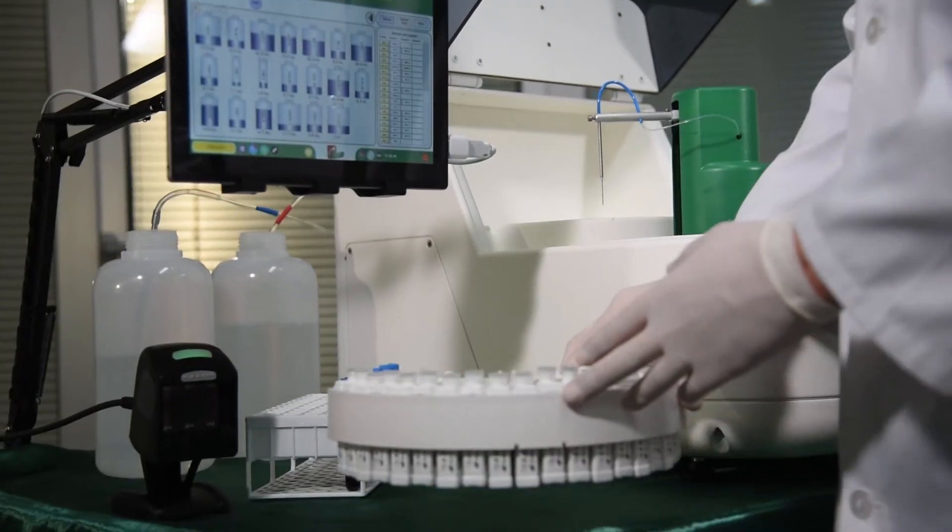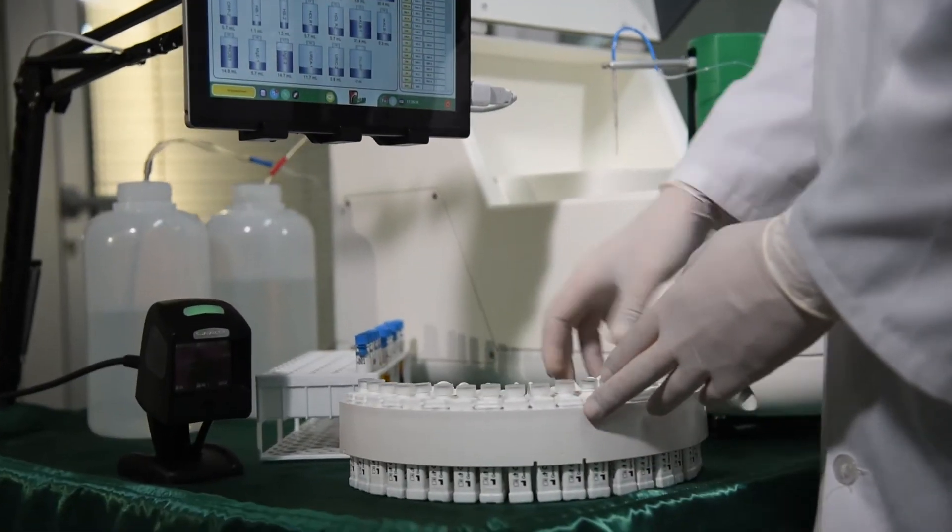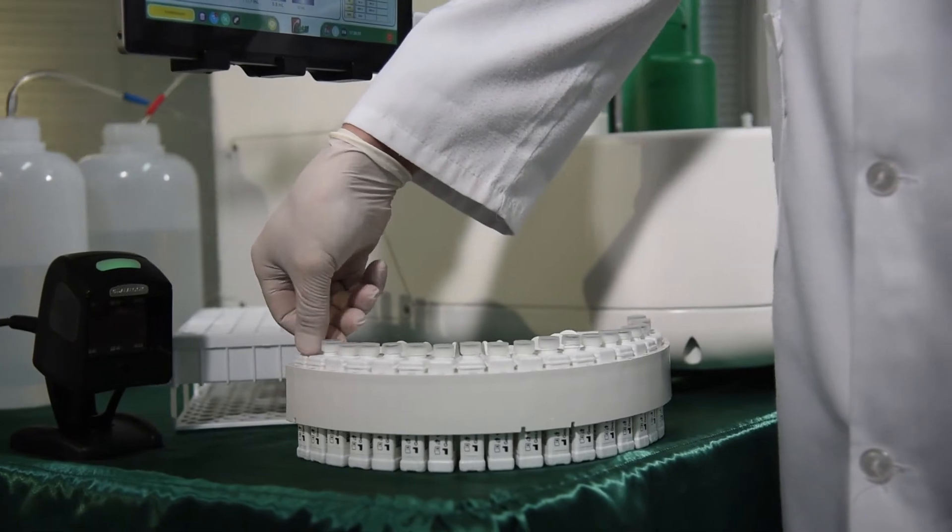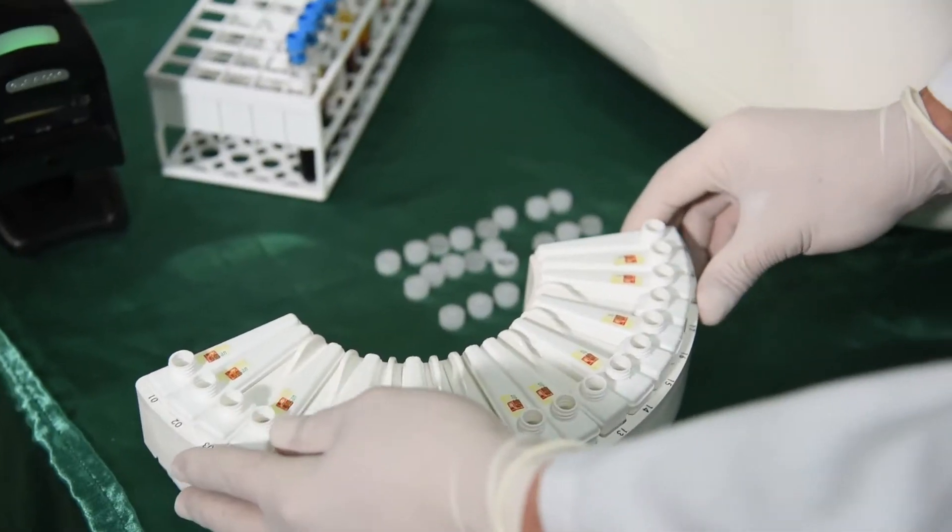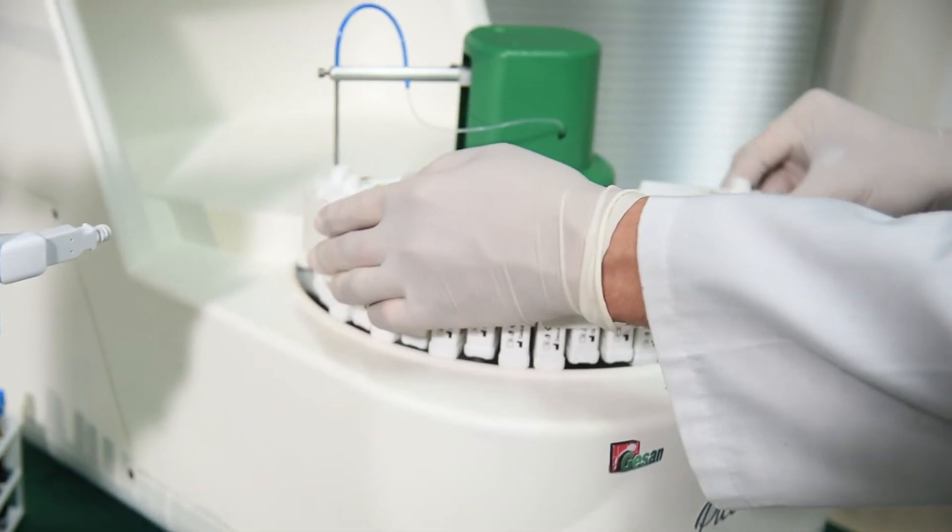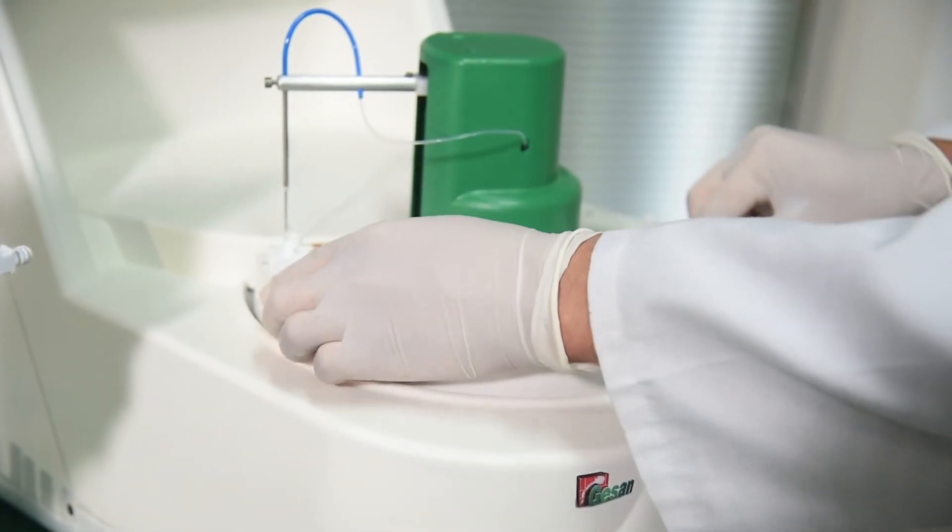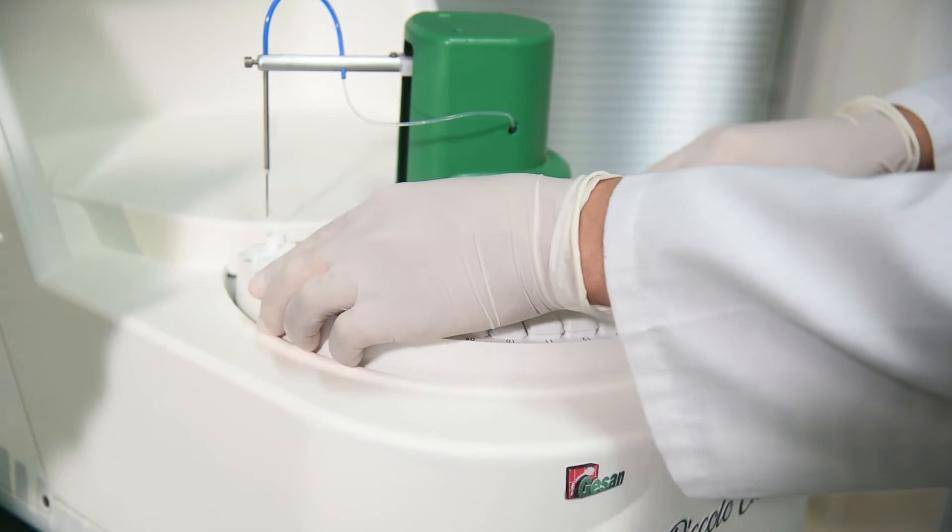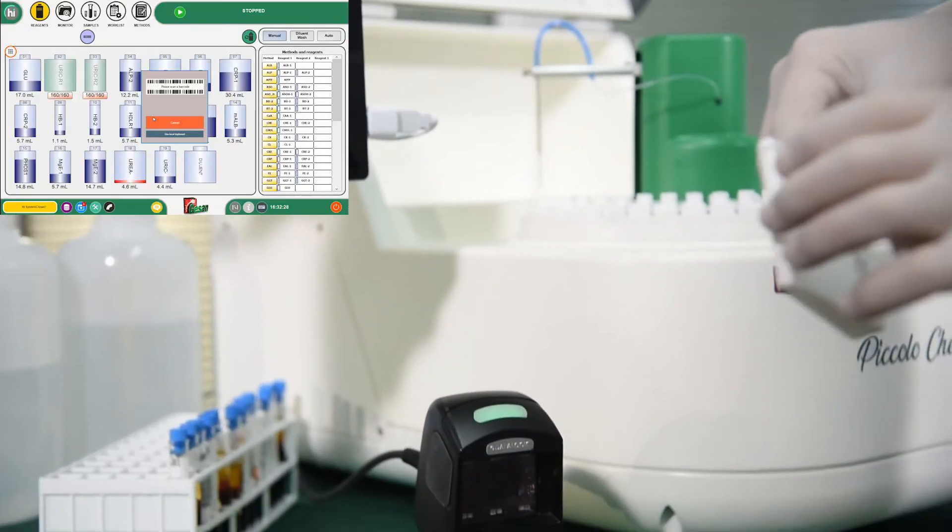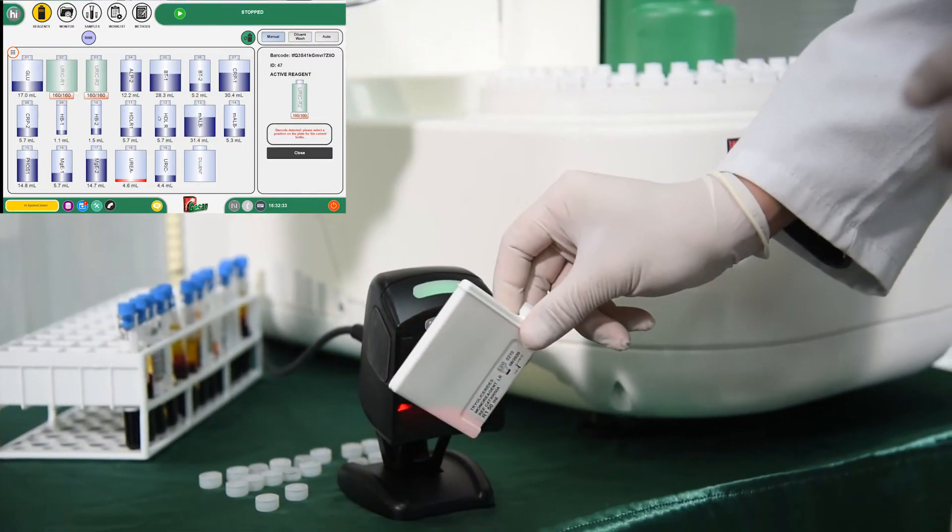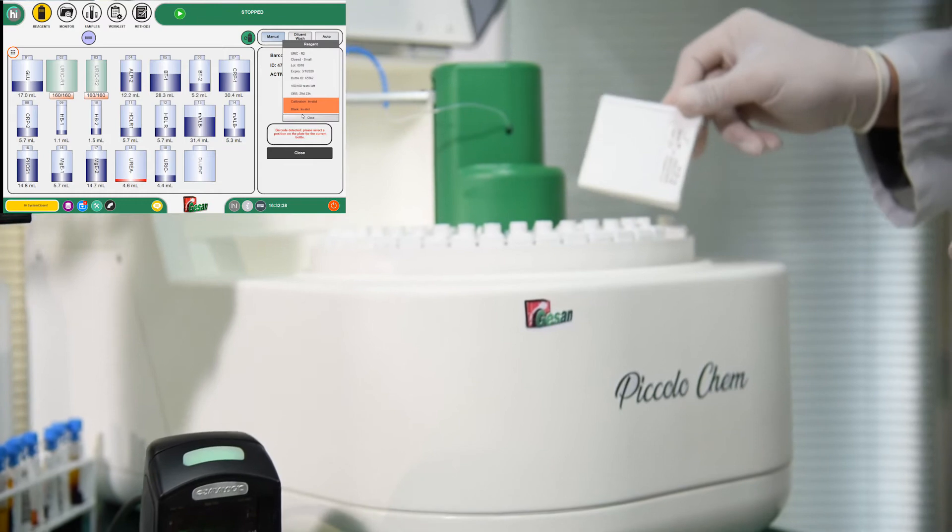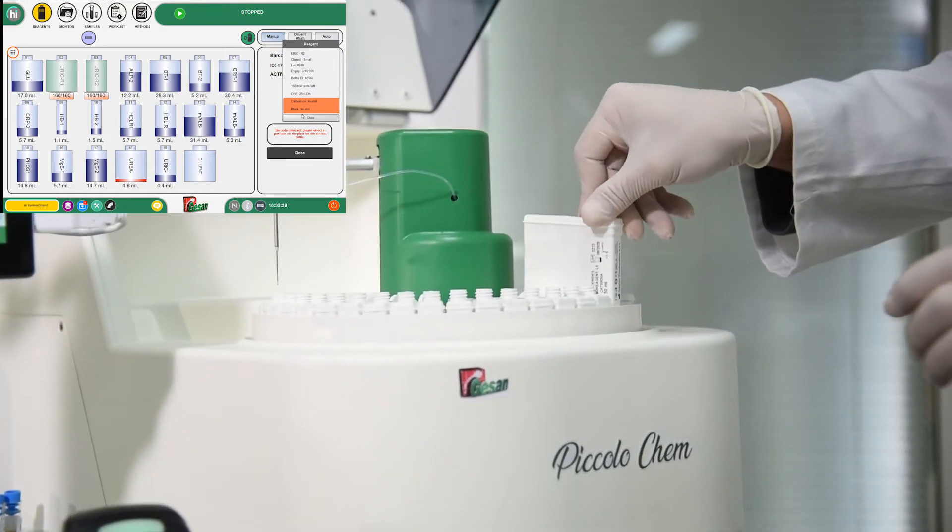Piccolo CHEM has 20 positions for reagents and 10 for samples. The loading on board of the reagents takes place by reading the barcodes, which provide the software detailed data on the individual bottle.